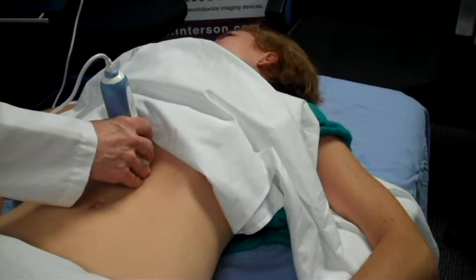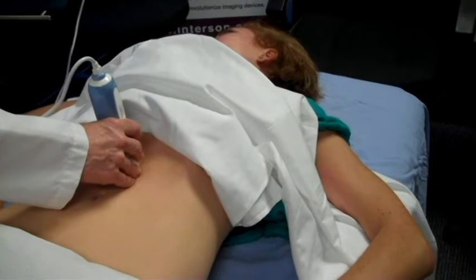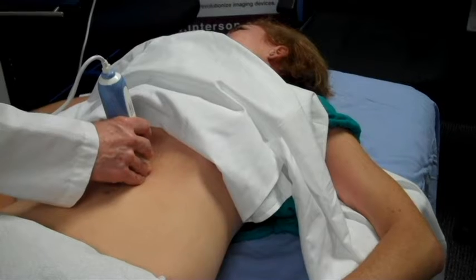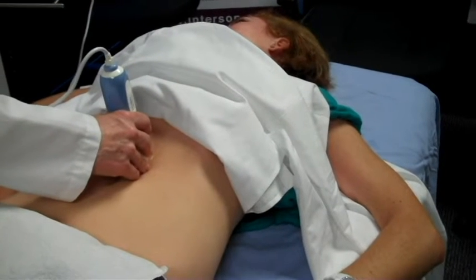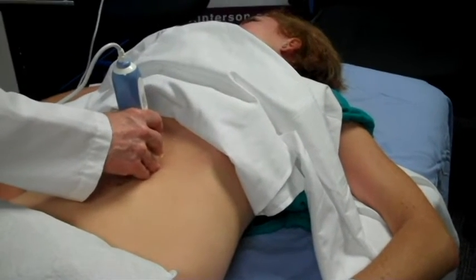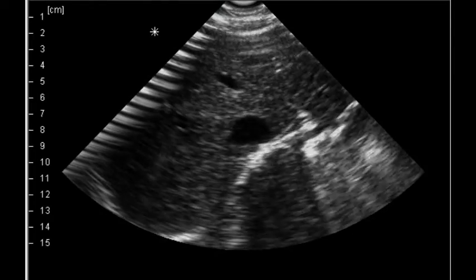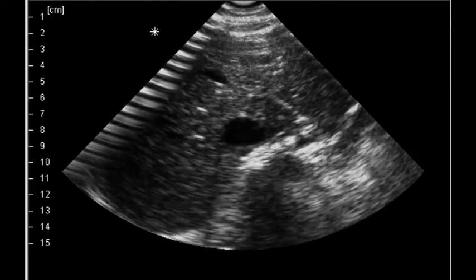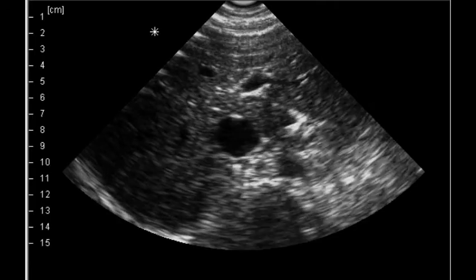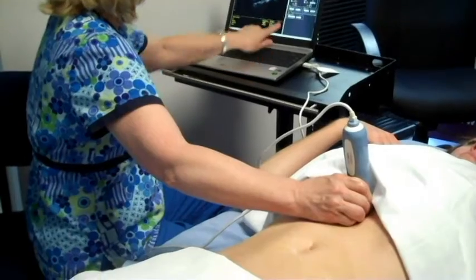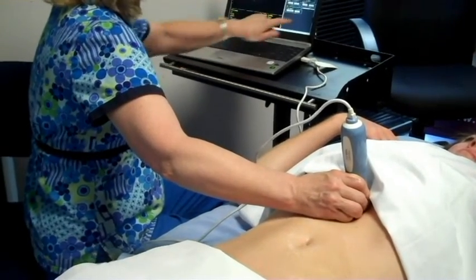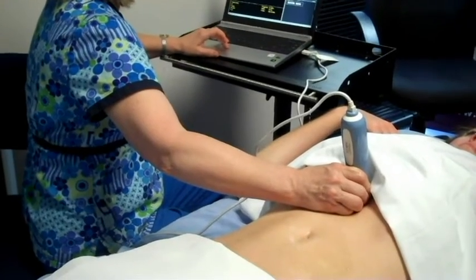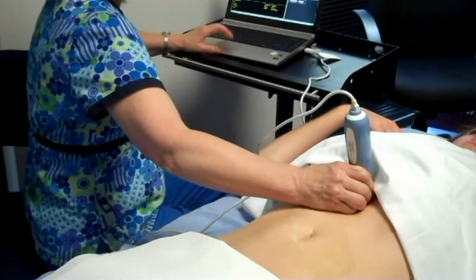Start the exam by placing the probe below the xiphoid in the transverse orientation with the button pointing to the patient's right side, and slide down toward the umbilicus. Identify the aorta as the pulsating anechoic structure next to the vena cava. You can identify the bright echoes of the spine deep to the vessels. Freeze the image and make a distance measurement, placing the cursors on the outer wall of the artery.